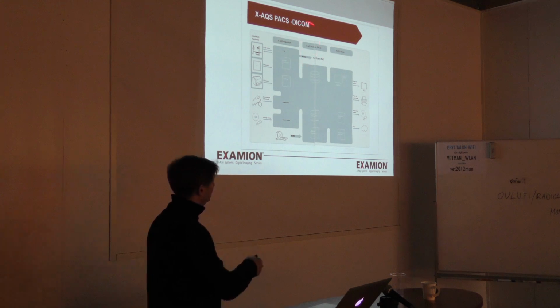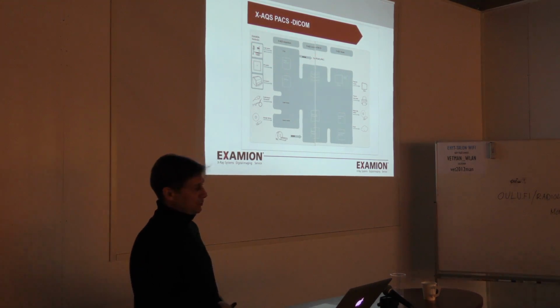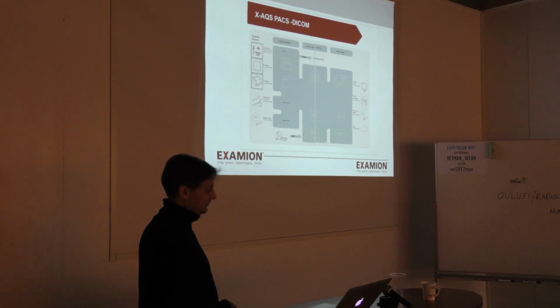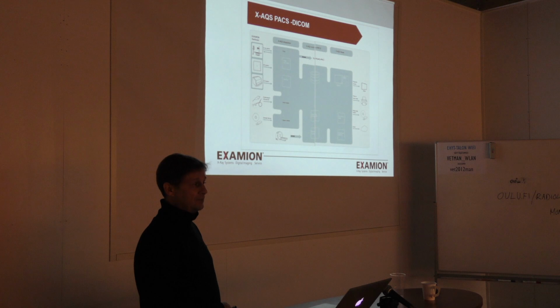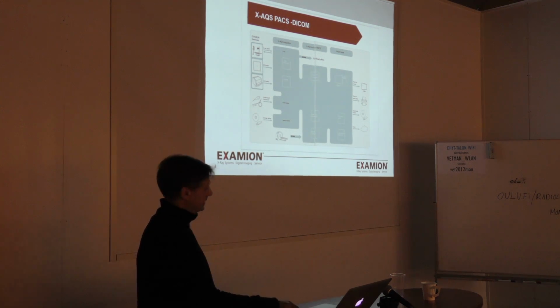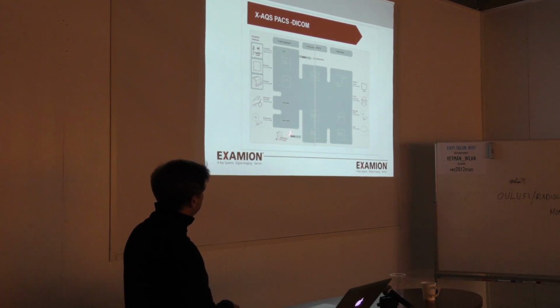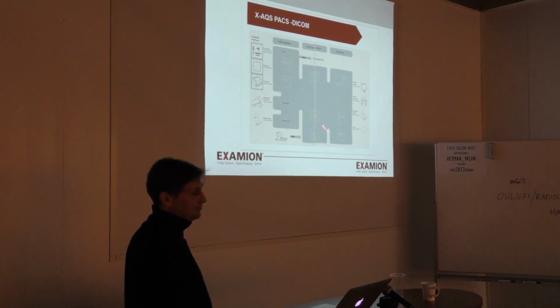So if you have many developers who make these products, you will actually have a big case of paper declaring that everything is DICOM, and they have to redo that every time they make a new development. So it's not because they had it once that they can stop. On the other side, if you already have a device, in this case for example a CT, which is also sending DICOM pictures out, any software which is PACS and DICOM can simply use it, instead of doing the acquisition, for archiving and then viewing.